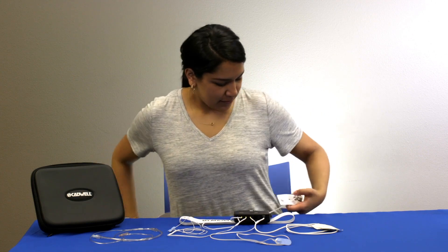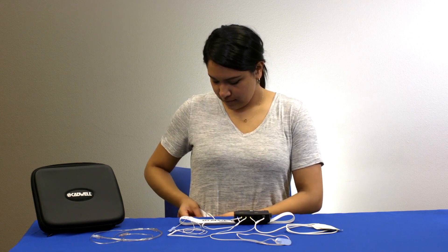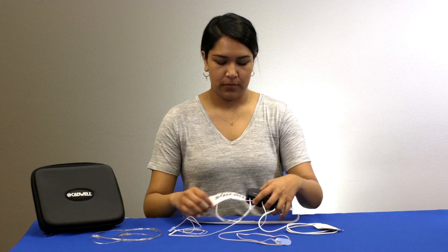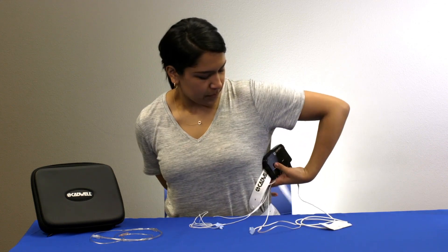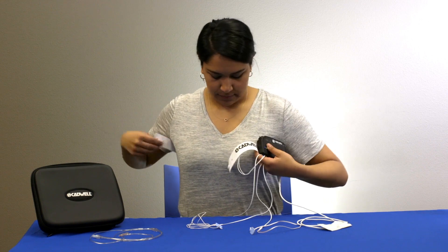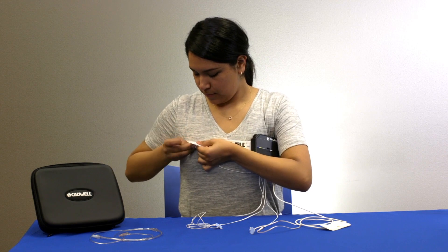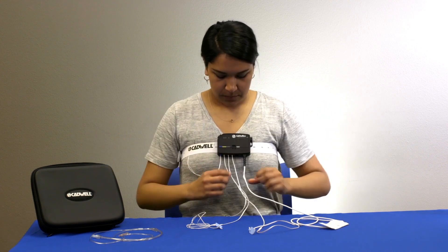Place the abdomen belt around your belly button and stretch it so that the belt is snug and comfortable. Fasten the belt by pulling the hard plastic button through the nearest slot in the belt. Place the chest belt around your chest so it is snug and comfortable too. Slide the apnea track to the center of your chest.